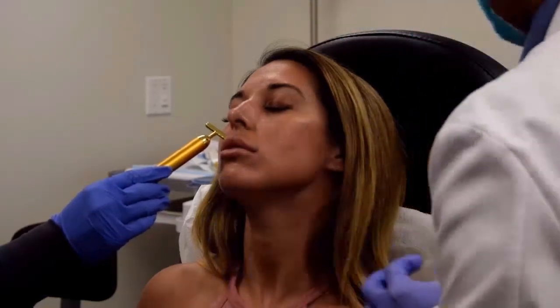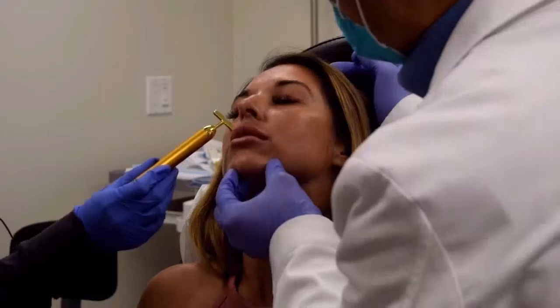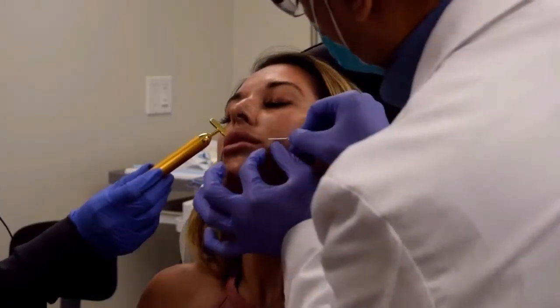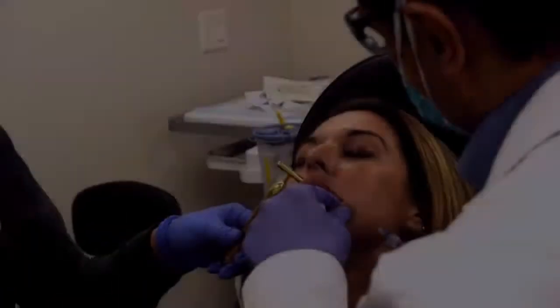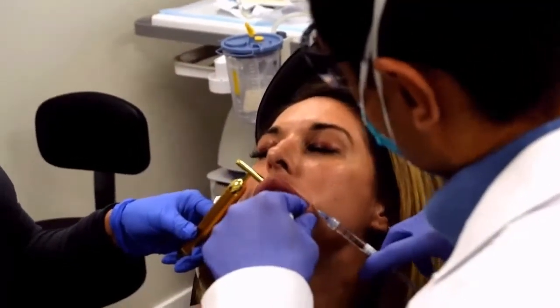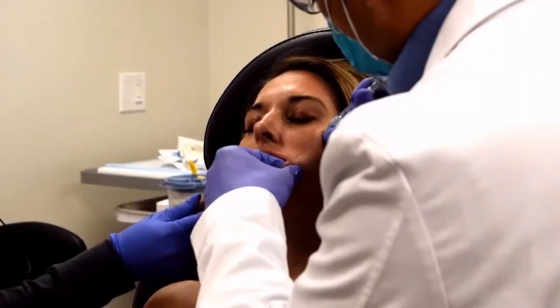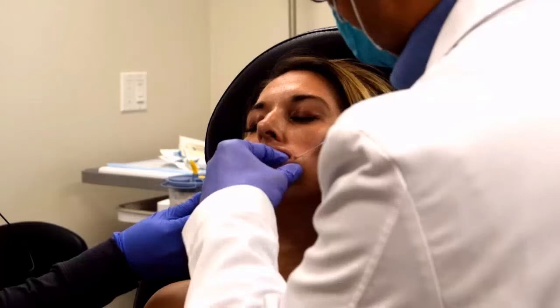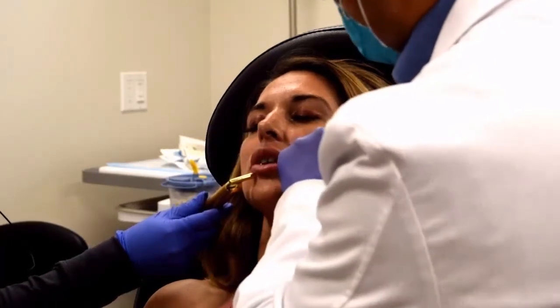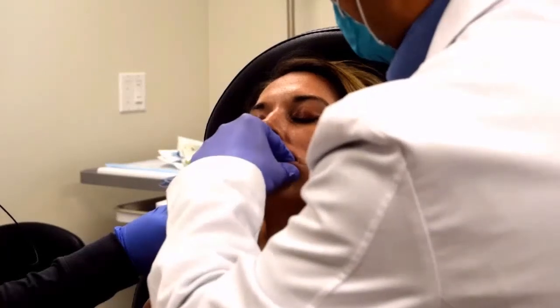We wanted to demonstrate our cannula lip filler technique. This technique essentially utilizes a blunt tip cannula for the administration of lip filler. Initially I did a little bit of local anesthetic followed by a little guide needle insertion site. Now you can see me introducing a 22 gauge cannula. The cannula goes into the upper and the lower lip in one fell sweep and the injections occur in a nice smooth linear fashion.